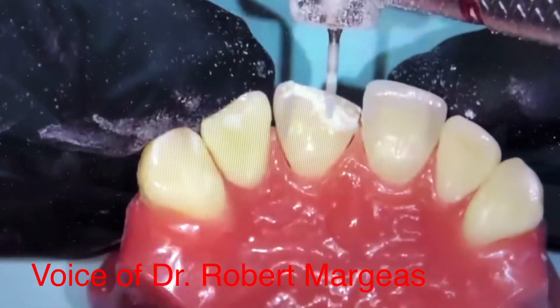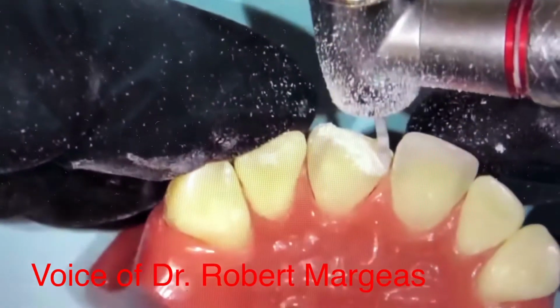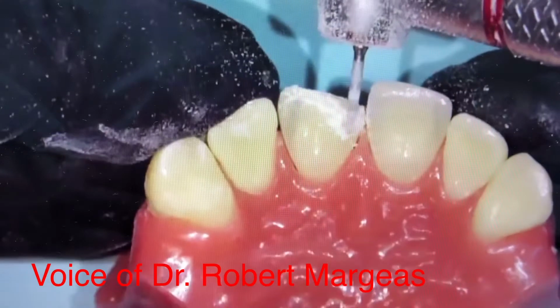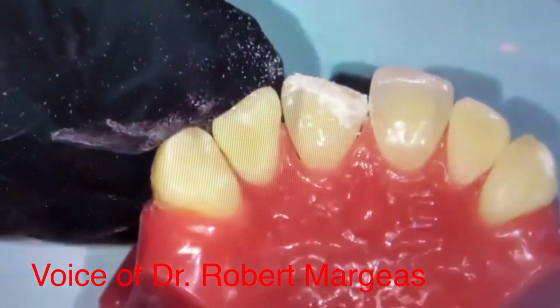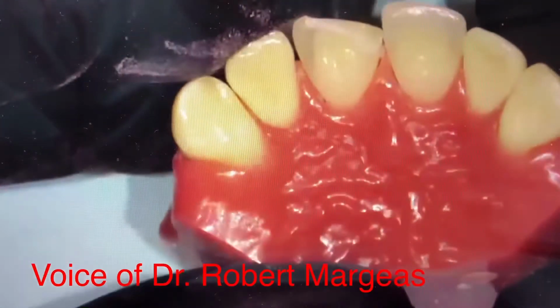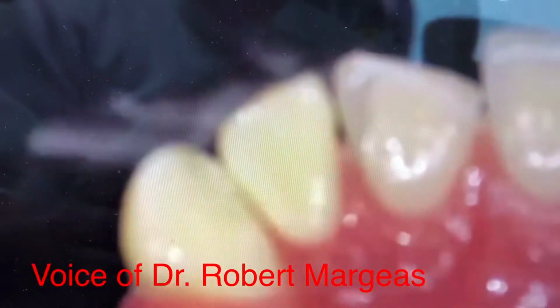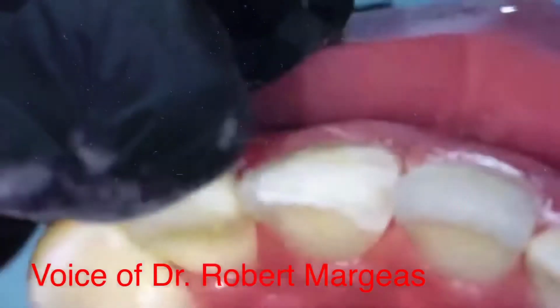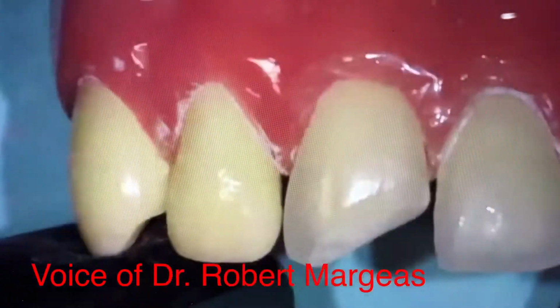If I do a short bevel on the facial, it's going to show. And then I can kind of round this here in the interproximal. Okay, let me blow that off and show that to you. You can see on the lingual, let me zoom in here a second. So you can see that. On the lingual, it's just a small little bevel. On the facial, it's a longer bevel of a couple millimeters.